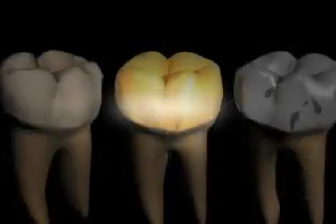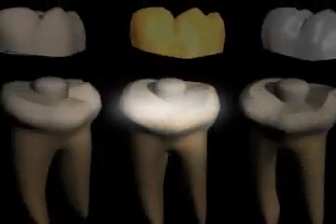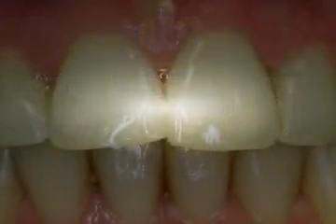What really makes a difference to the price can be seen from a few steps in the procedure. Let's show those steps to you now and then explain the price range. We'll start with the aesthetics.